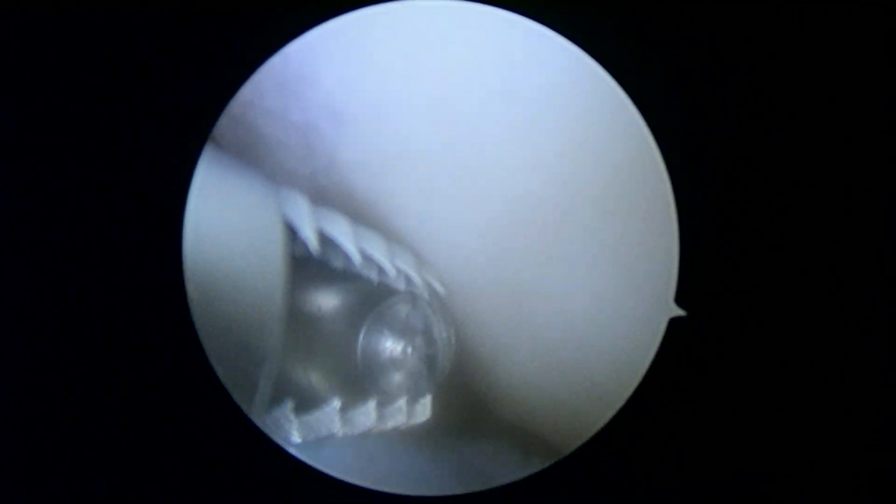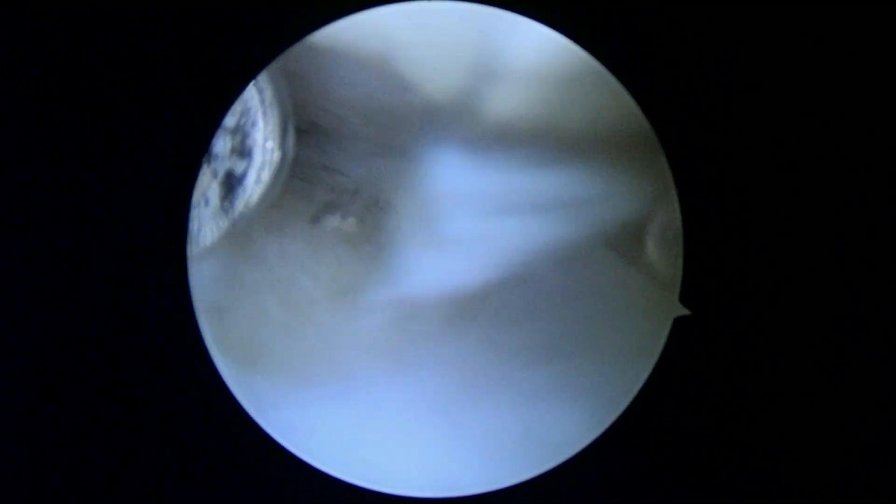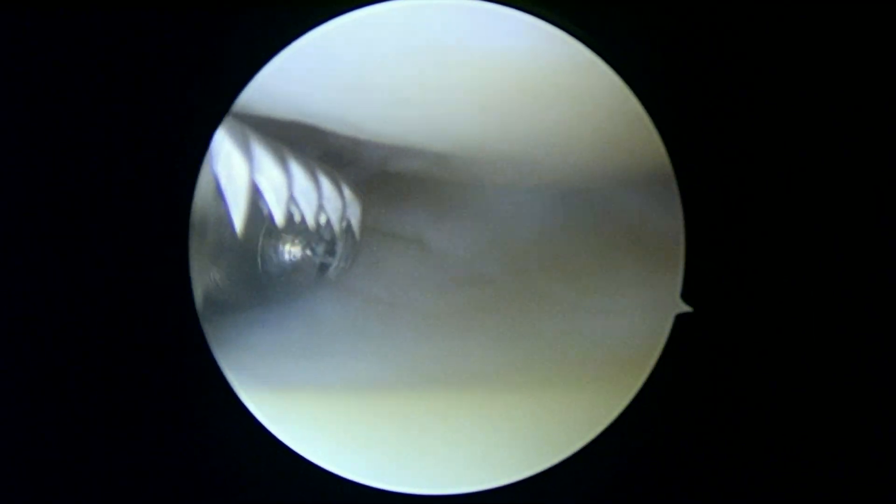Now we're going to look in the lateral compartment because we know there's a tear here and we'll see what we have to do to make this better for you. This is exactly what the MRI scan showed — kind of this body and anterior horn tear. Sometimes we can take care of it pretty quickly just with our shaver.